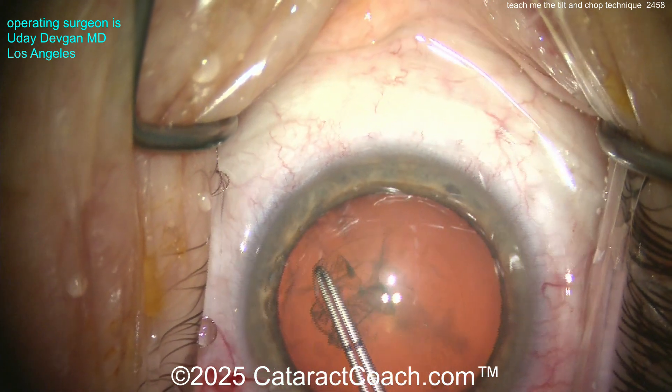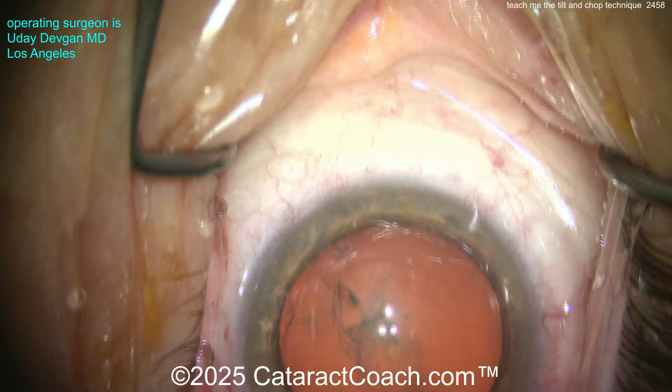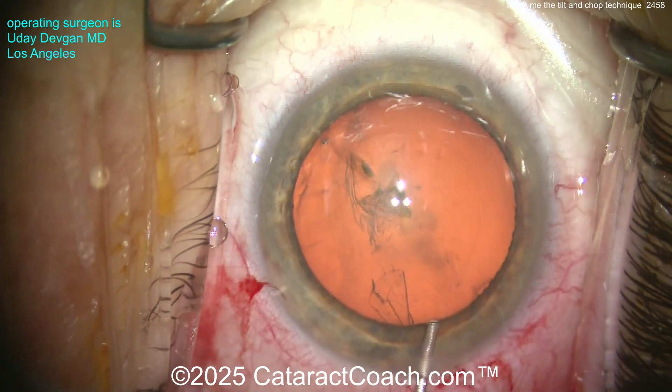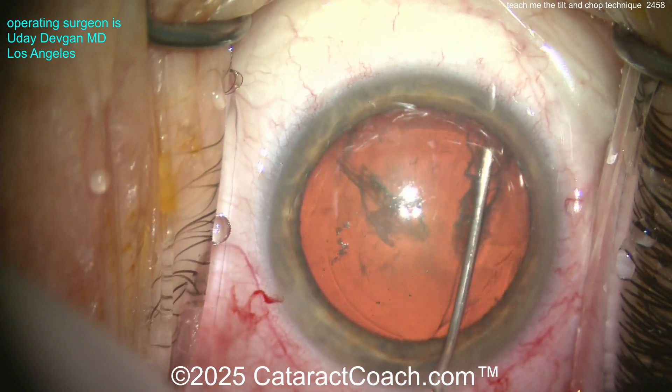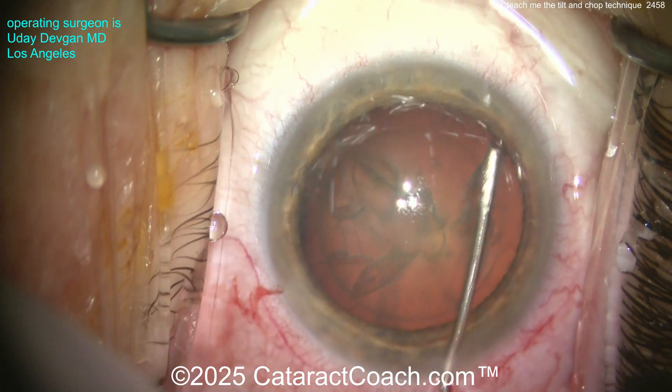I'm creating a nice round five to five-and-a-half millimeter rhexis. Let's measure here at the end and see how I did. I didn't measure it — going on skill. That looks about five, five-point-two, five maybe. We'll find out at the end.